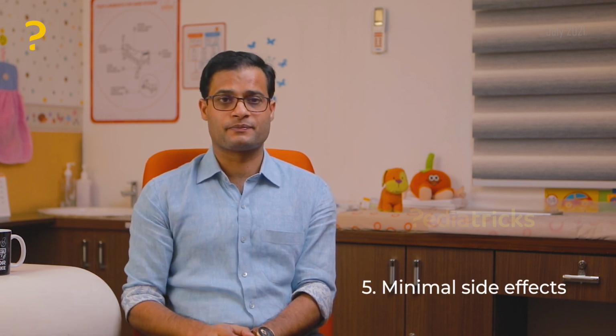Another major advantage of an inhaler is a decrease in side effects, because if you are using an oral or systemic medication, it has to go to the circulation, increase the blood levels, and then give some relief. But here you are directly inhaling. There is a direct effect on the area where there is the real problem, and then it is exhaled out, so the side effects are very minimal while using an inhaler with spacer.